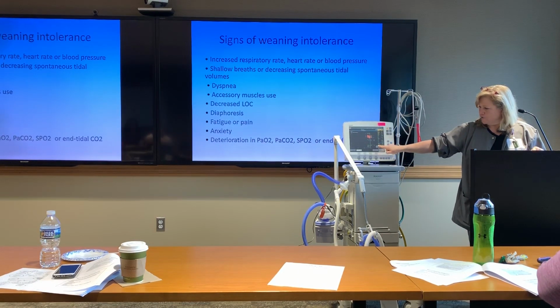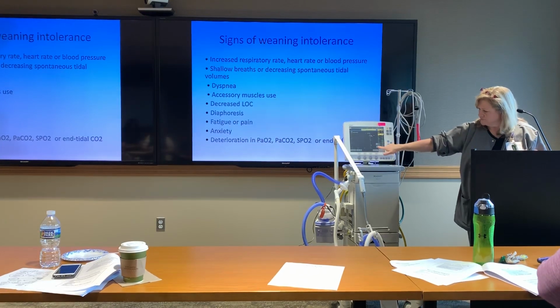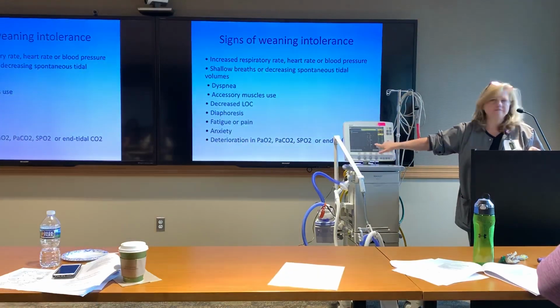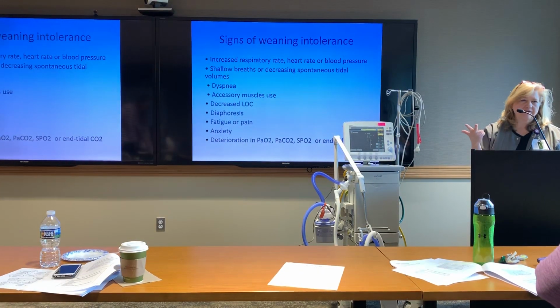If you dig deeper, keep going, you can find, I hope, one more, I think. Come on. Oh my God. You gotta dig deep. Sorry, I'll get there. There it is. Something called SBI, Spontaneous Breathing Index.